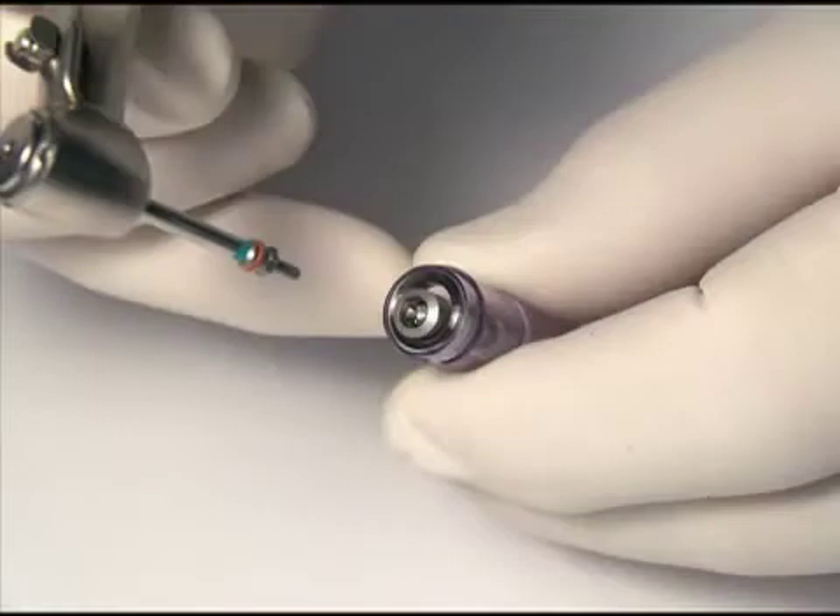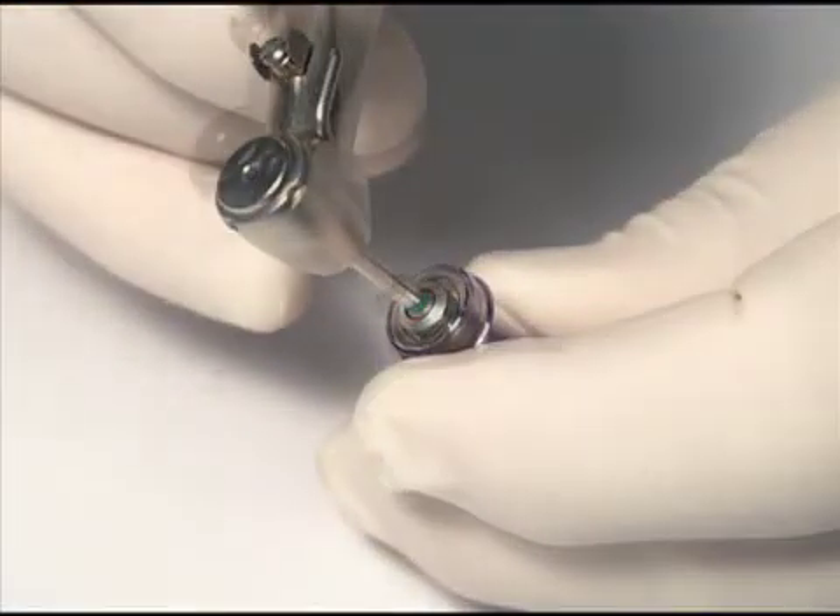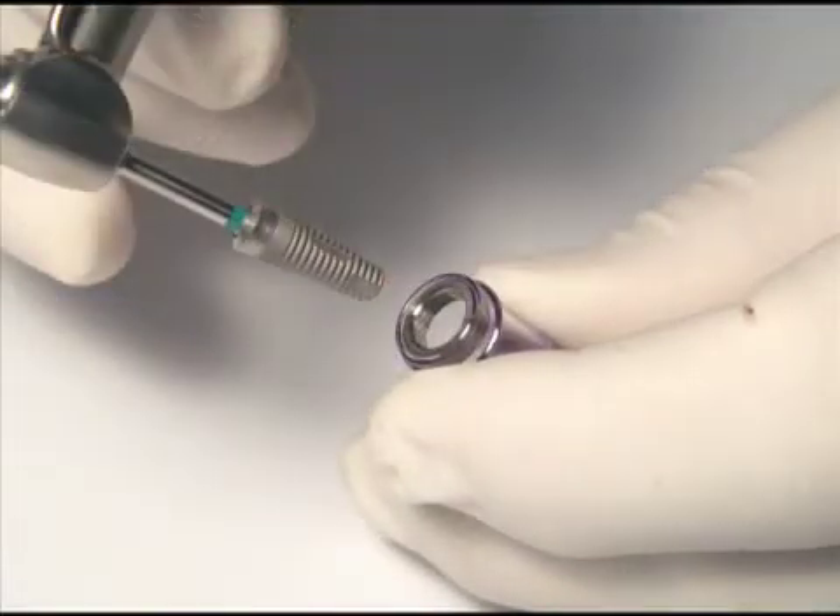Please note that Intraloc's patented drive lock attachment enables the removal from the package through delivery and placement of the implants in one uninterrupted motion. This driver is also used to place the cover and laboratory screws.